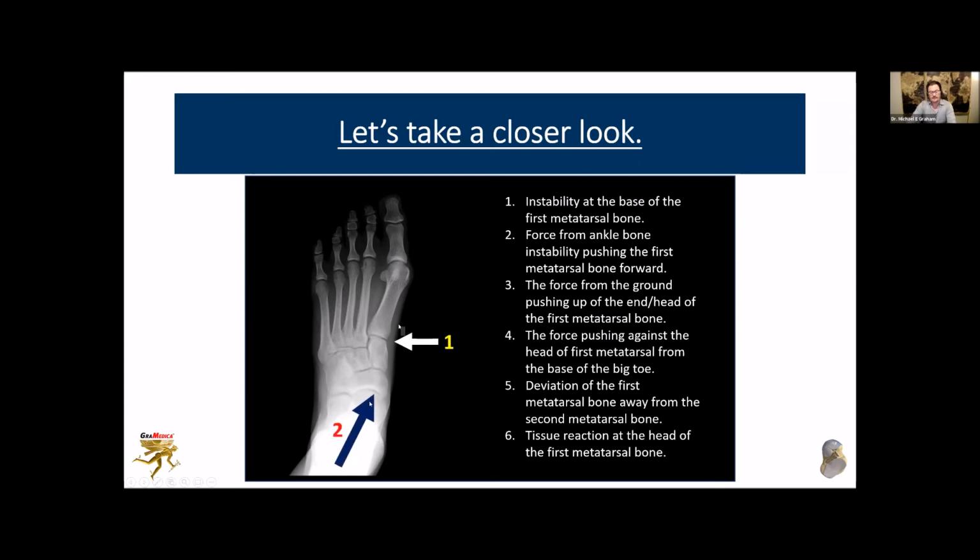So we have the talus that is abnormally aligned. It's partially dislocated on the calcaneus, and then that causes this trickle down effect that leads to the excessive forces and misalignment at the first metatarsophalangeal joint. And then the periosteum is being pulled on the dorsal medial head of the first metatarsal, and that's why you end up with the bump.